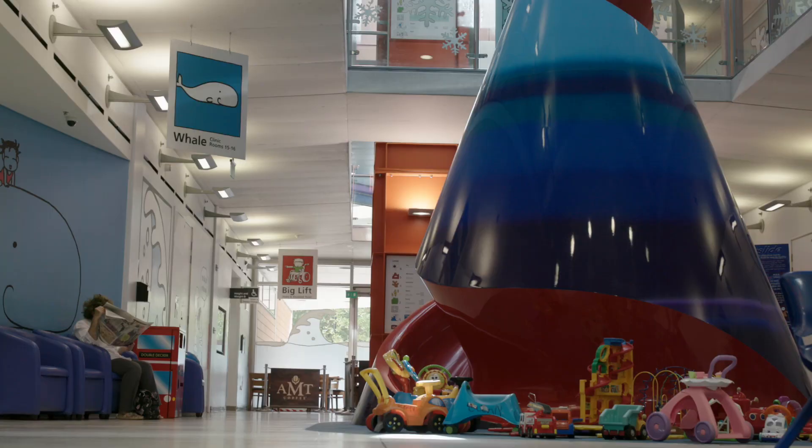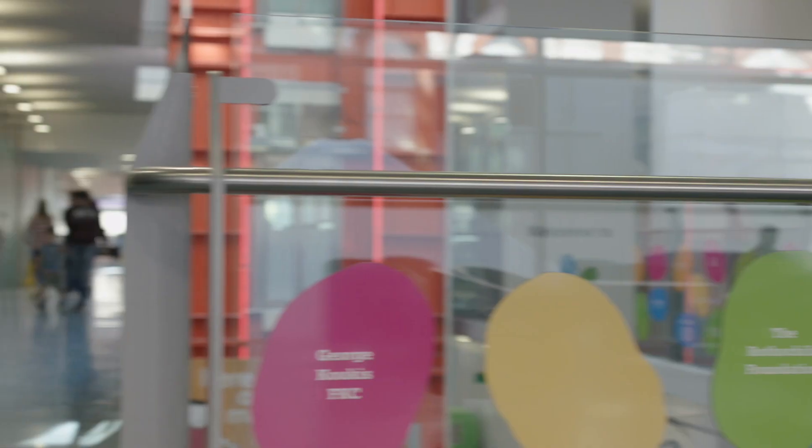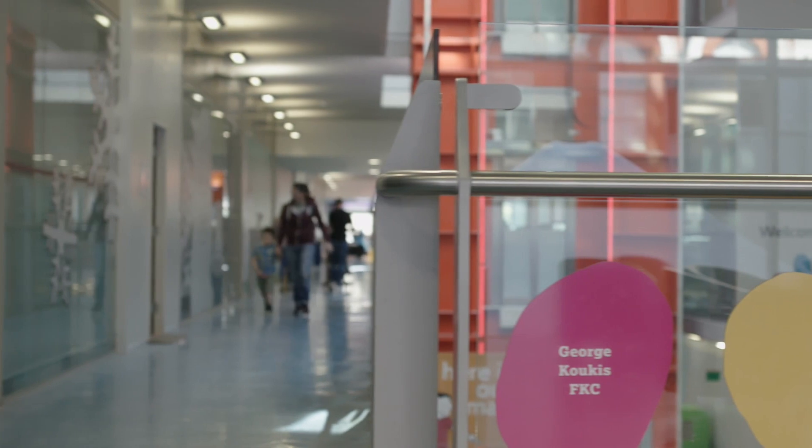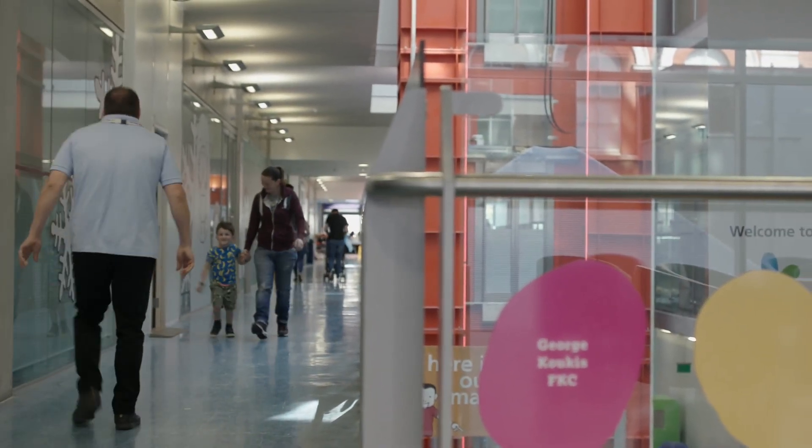I'm Claire and me and my son Ryland have come along to the Evelina Hospital today so he can have a home telemetry. I'm not sure what to expect but we'll see how it goes.